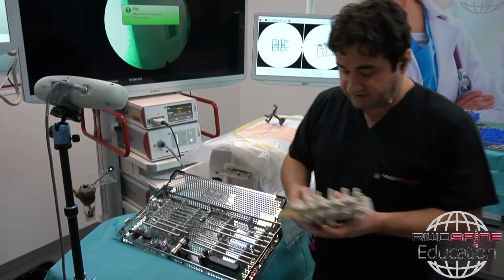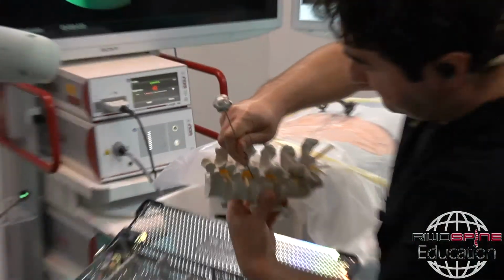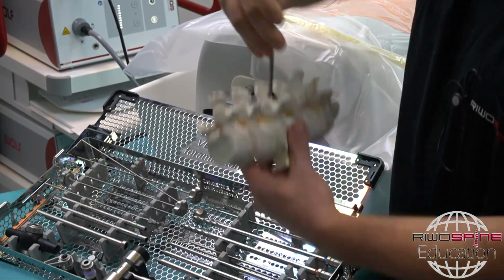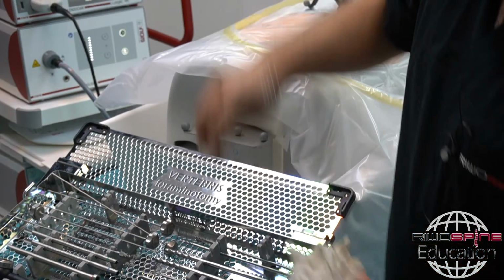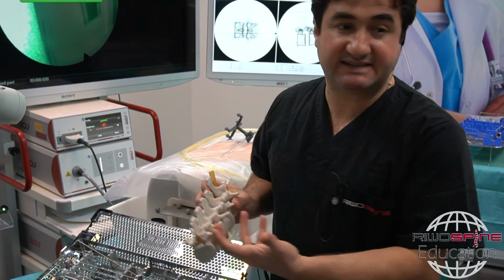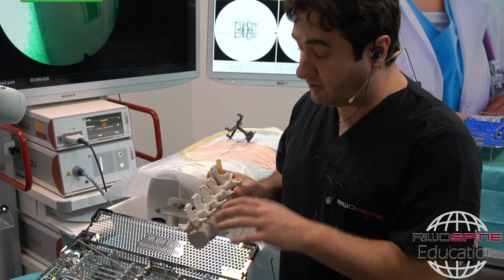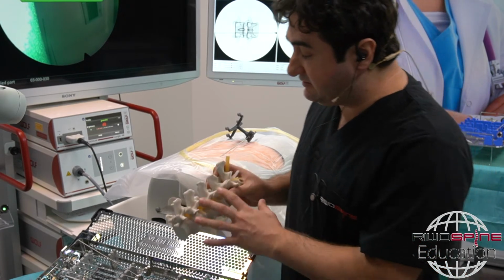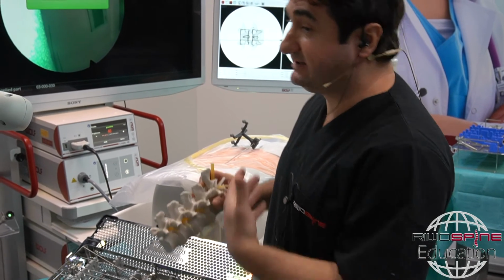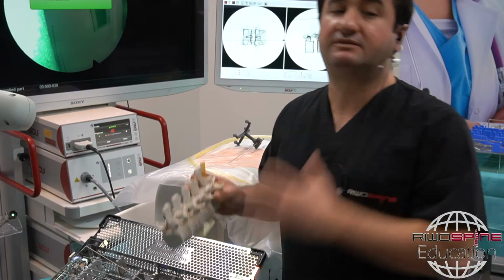But as we talked, the second option is you can dock on the annulus like that, and you can start directly with the lateral cutting burrs, and you can enlarge the caudal side of the foramen. As we talked before, we do this only to get better access to the spinal canal. It doesn't mean that you can decompress the recess with this. It's not easy with the manual drills to decompress the exiting nerve root, because the exiting nerve root is located in the cranial side, and you can only use the manual burrs in the caudal side of the foramen.